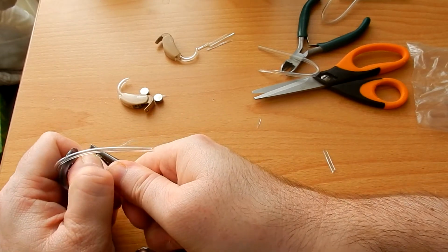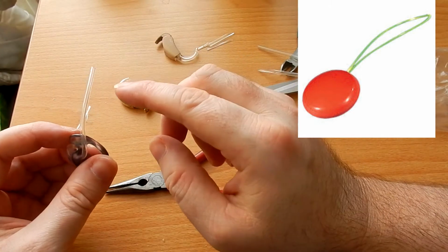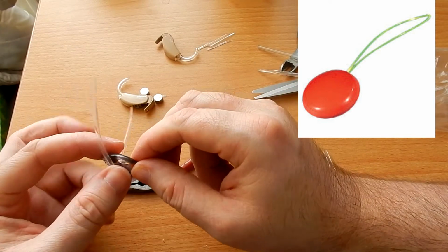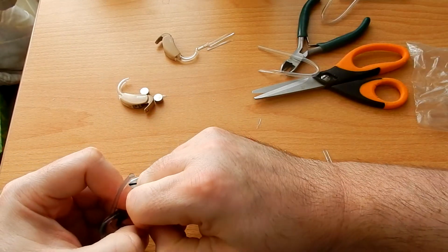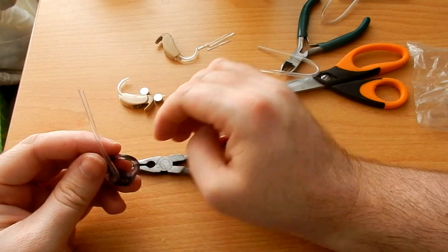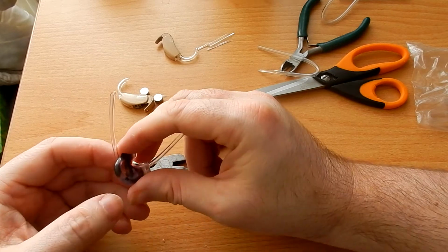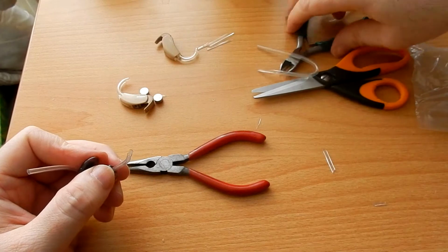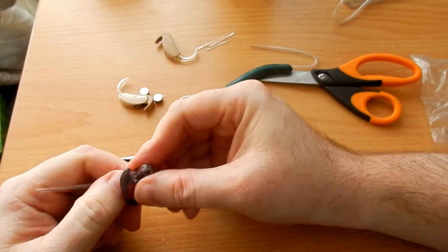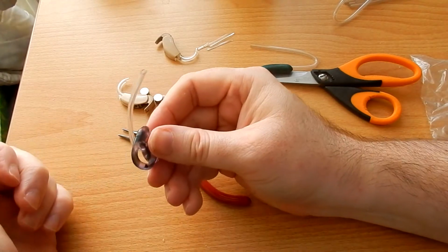There are tools available that will help you pull the tubing through. I will show you a picture. It'll be up on the screen somewhere. Right, what we have now is the tubing pulled through to the arm there. We then take a pair of side cutters, chop the end off there, and pull it back through slightly so that it doesn't irritate your ears.